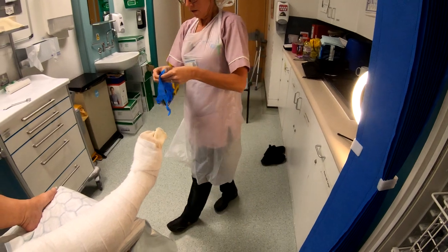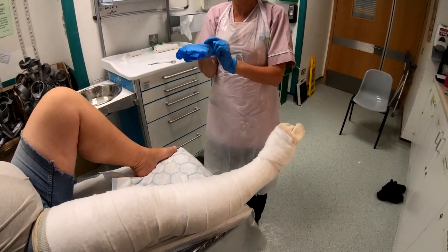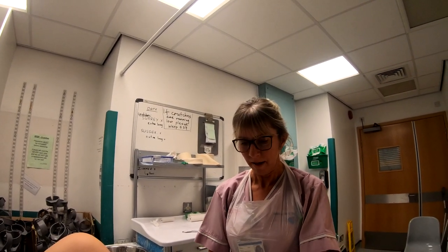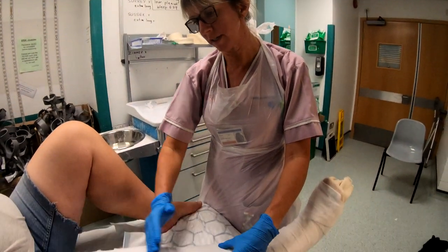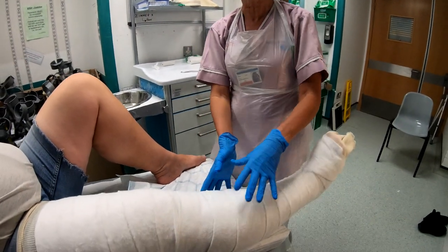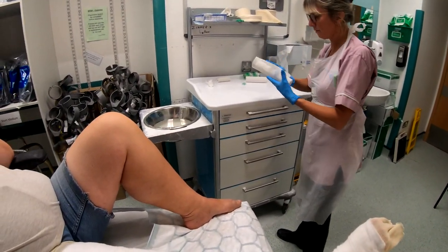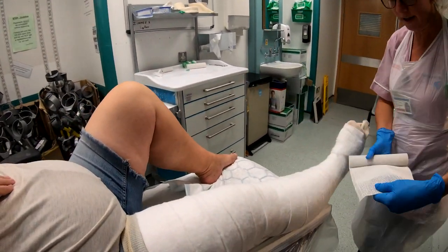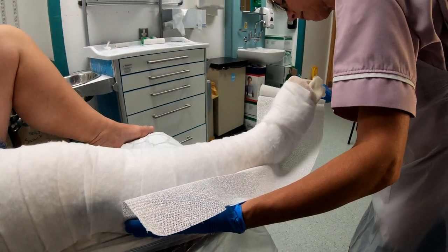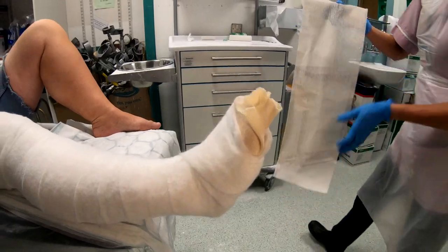We're going to cut out the below-knee first, but when we actually apply the plaster, we're going to do the above-knee first, because generally for these types of injuries — either a proximal tibia injury or mid-shaft — we need to extend. So we immobilize the knee first, which generally gives the patient comfort, and then do the below afterwards. So we'd prepare it in reverse. We won't lift the patient's leg up because that's too uncomfortable. Just take the normal measurement to the below knee, behind the heel and up to the ball of the foot.